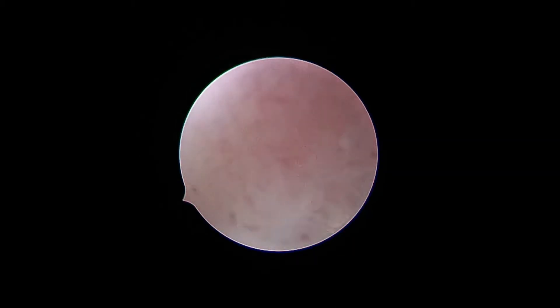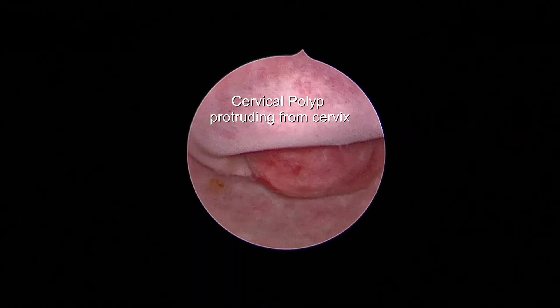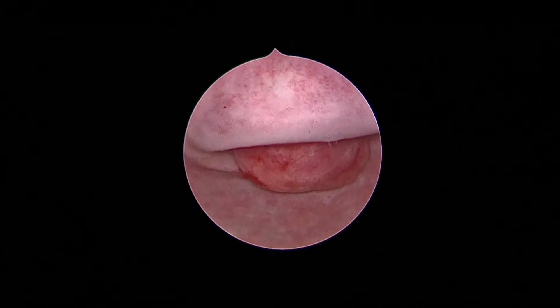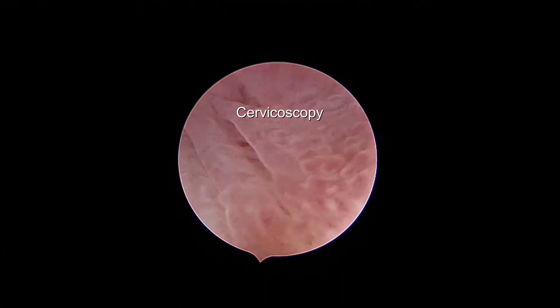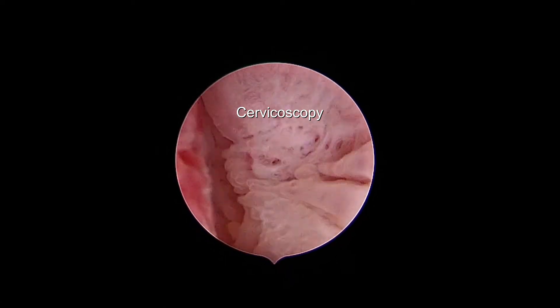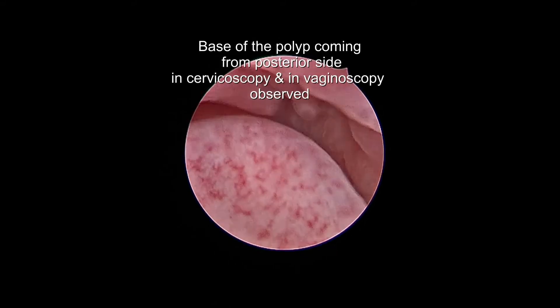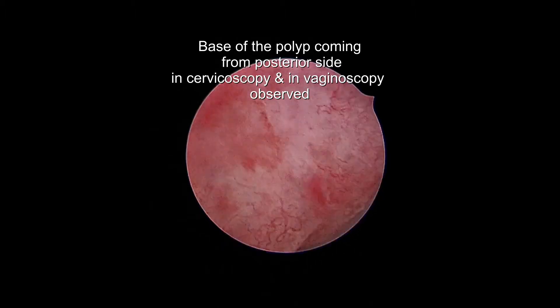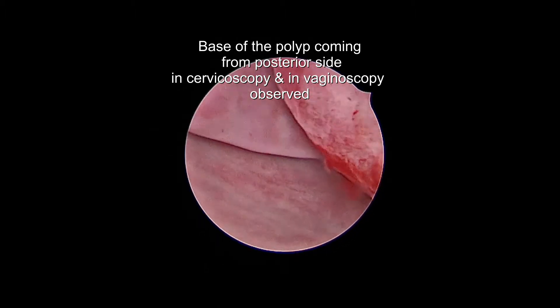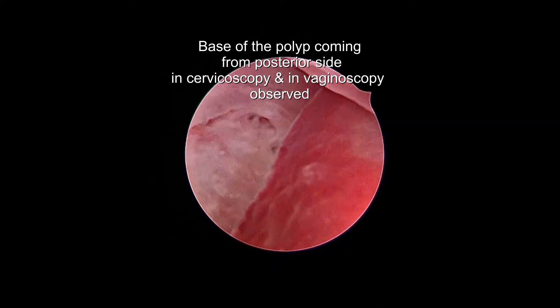We started with vaginoscopy. You can see the cervix and a cervical polyp protruding from the cervical canal. This is a cervical crypt. Cervicoscopy means you move the scope circumferentially around the polyp to find out where it is coming from — whether it is coming from the uterus. You can see the vaginoscopy view; again, this is the polyp, and circumferentially I am seeing the cervical crypts.